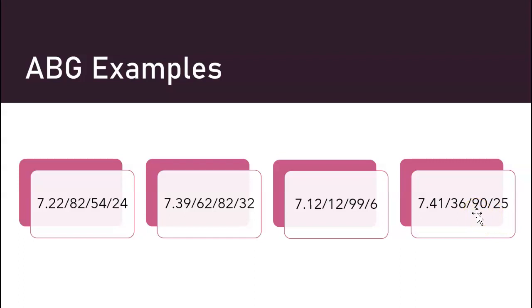Yeah, I put a normal blood gas because sometimes I feel like boards will just throw a normal one at you and then you feel like you did something wrong. So I threw a normal one on because I got a normal one on my boards and I sat and second guessed myself for like 10 minutes. I was like, what did I do wrong? What did I do wrong?